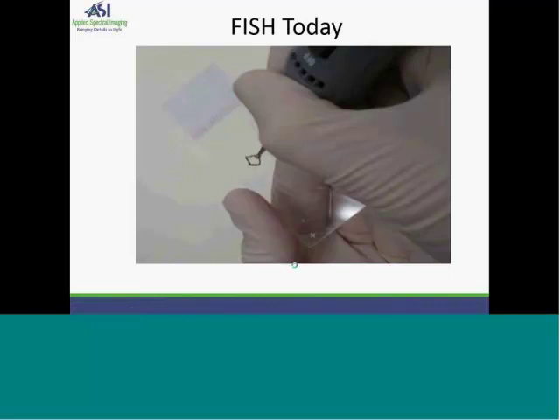So let's start by discussing how FISH is done today. The typical workflow goes something like this. A pathologist generally does not work in the same area as the FISH technician. And in order to instruct the FISH technician where to scan, the pathologist will mark off the bottom of a FISH slide with a diamond-tipped engraver, where it is believed that the region of interest is located. After receiving the marked slide, the FISH technologist will scan the encircled area and provide the pathologist with the scanned FISH image and analysis, which the pathologist will then review.